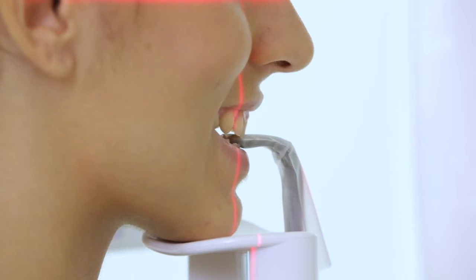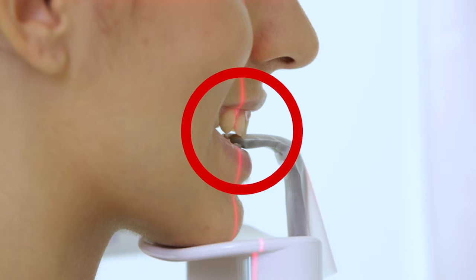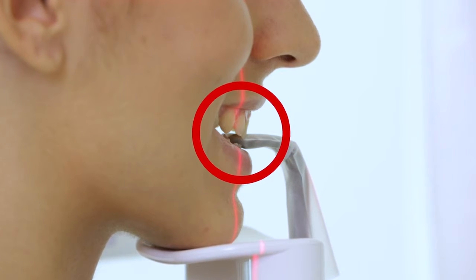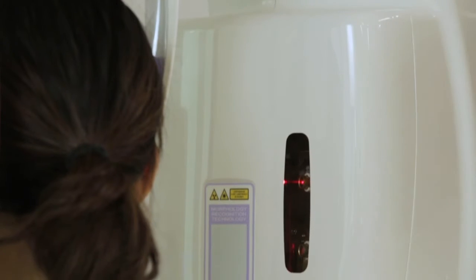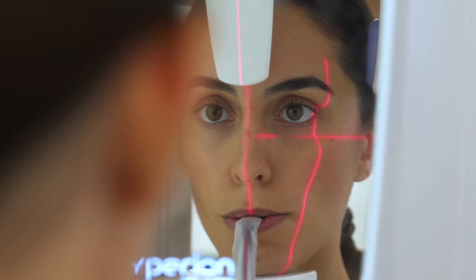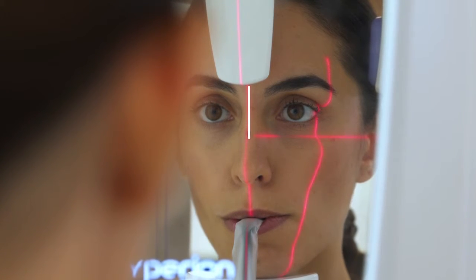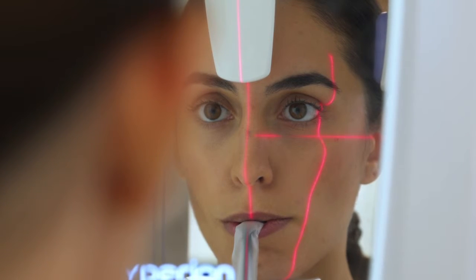By adjusting the height of the bite, the dentist asks the patient to make sure her incisors are in the groove so that the incisors' interproximal space is aligned with the bite's midline. To ensure maximum positioning accuracy, laser beam projections on the patient's face are needed. Adjusted from the onboard console, the 3 laser beams identify the sagittal, Frankfurt, and vertical planes at the canine.